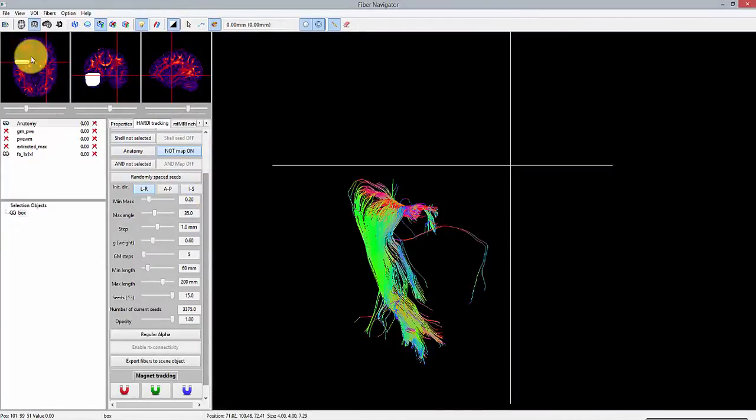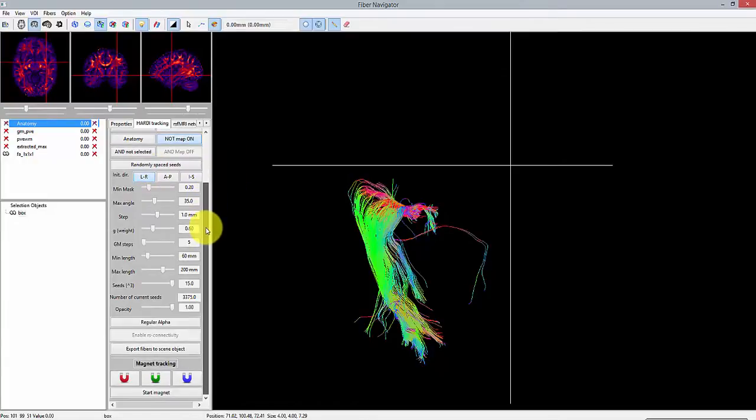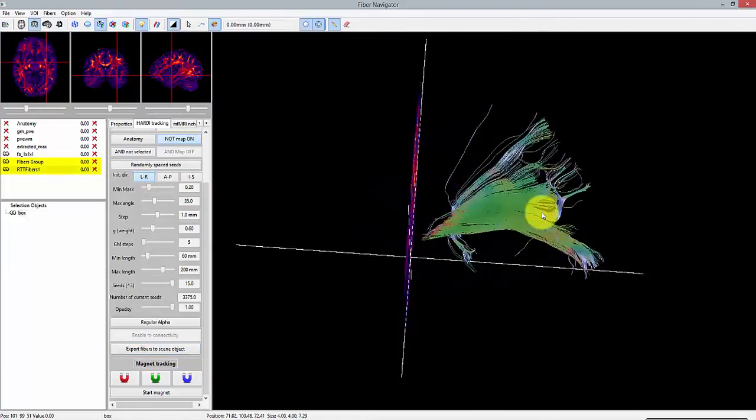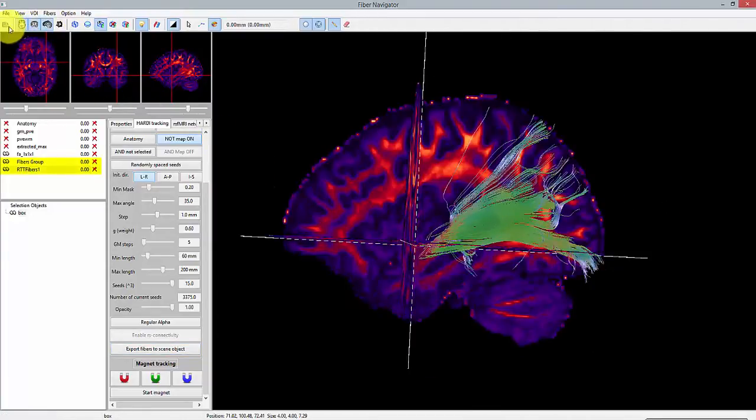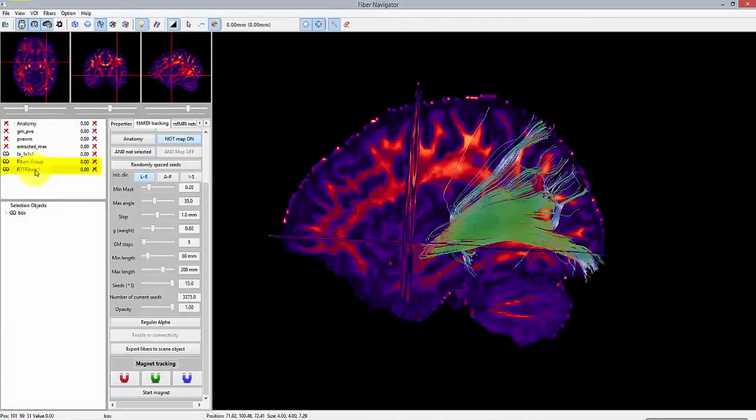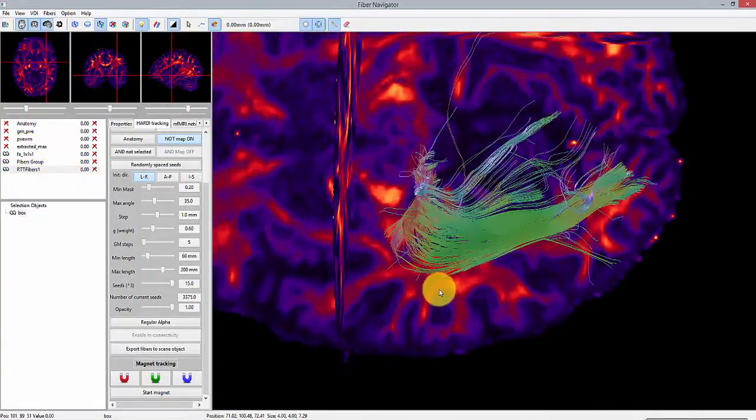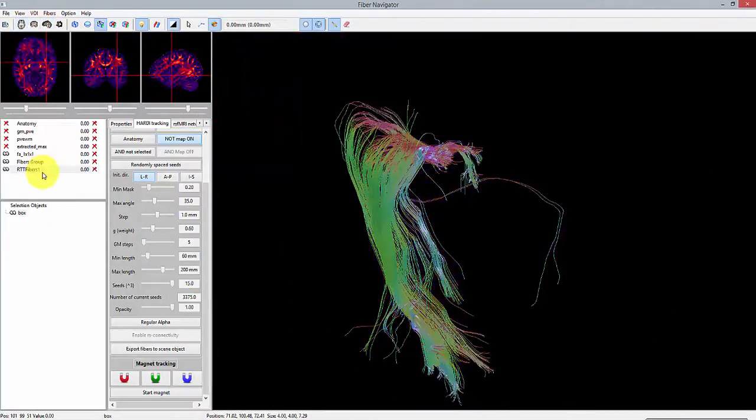The second method consists in converting the current track to a static scene object, which will appear on the list on the left. This allows the user to save his tracks on the disk as a VTK format, for example. From there on, you cannot change the tracking parameters anymore, but you can still interact with the track to apply different color maps, for example.